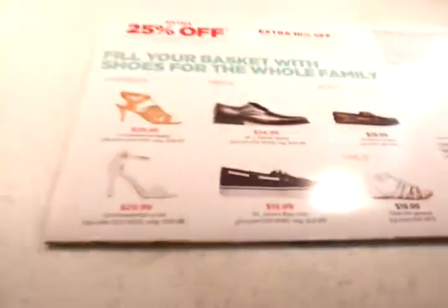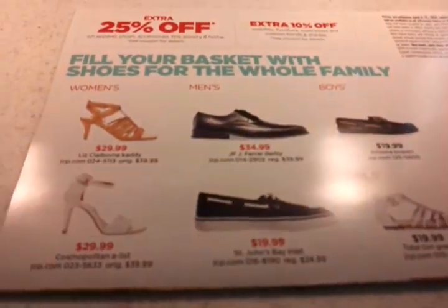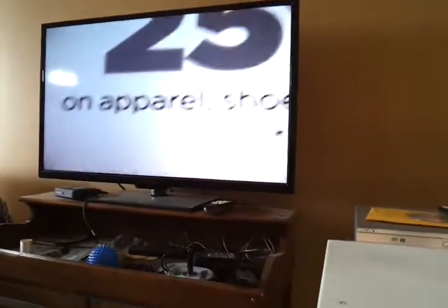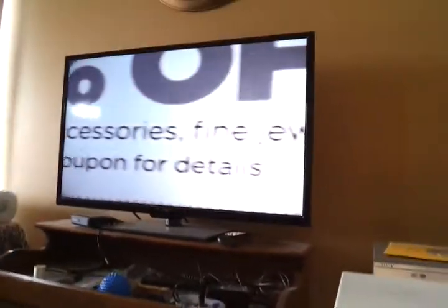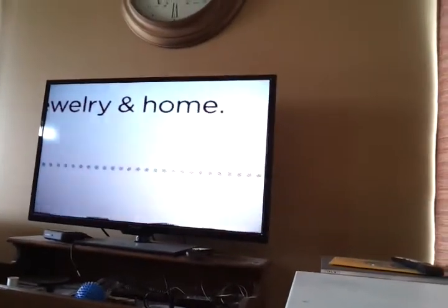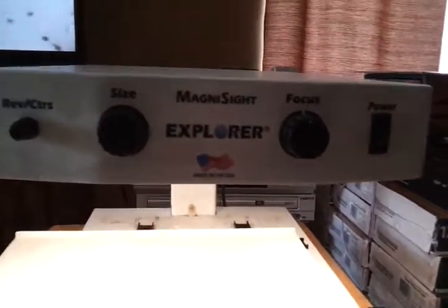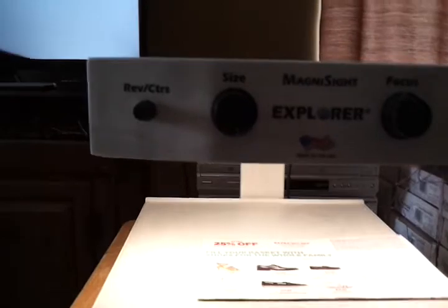That might be helpful for somebody trying to read small print — to be able to read the newspaper or a letter from a loved one. It does have a contour adjustment to make the image lighter or darker, and that's about it for features.